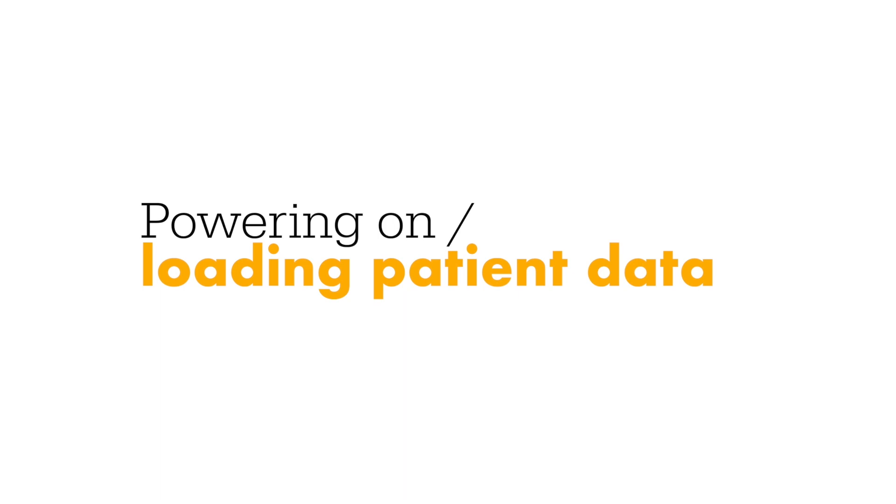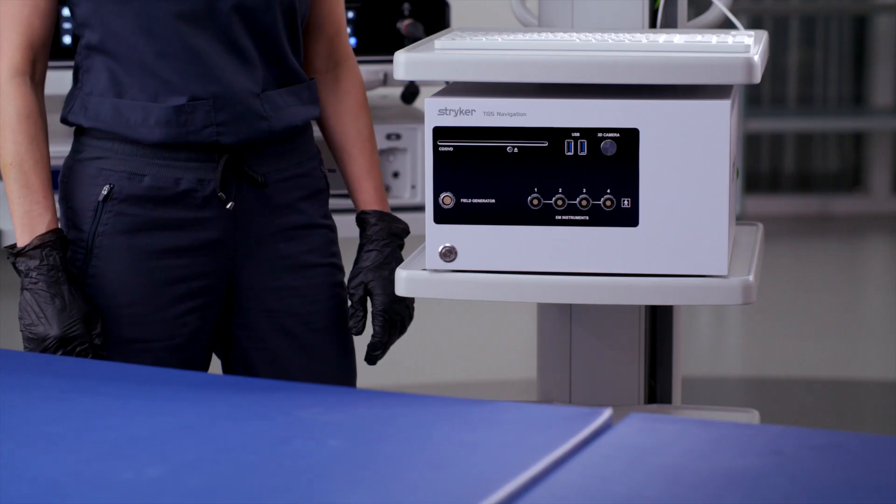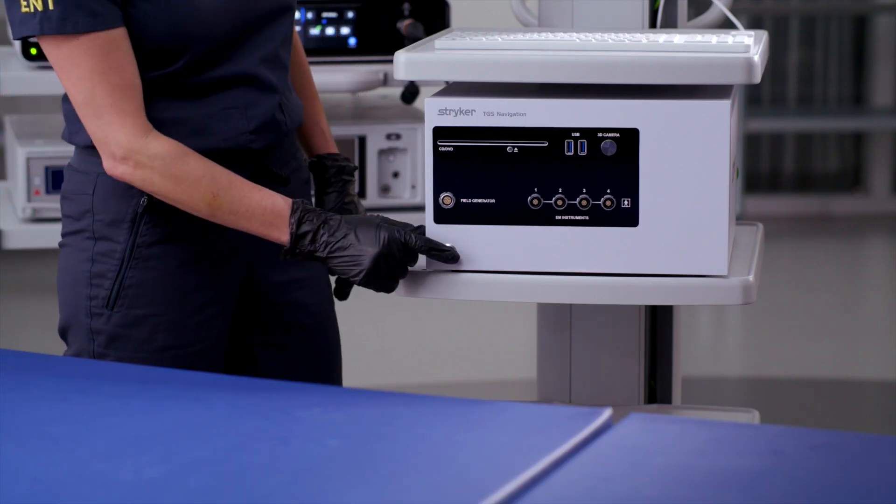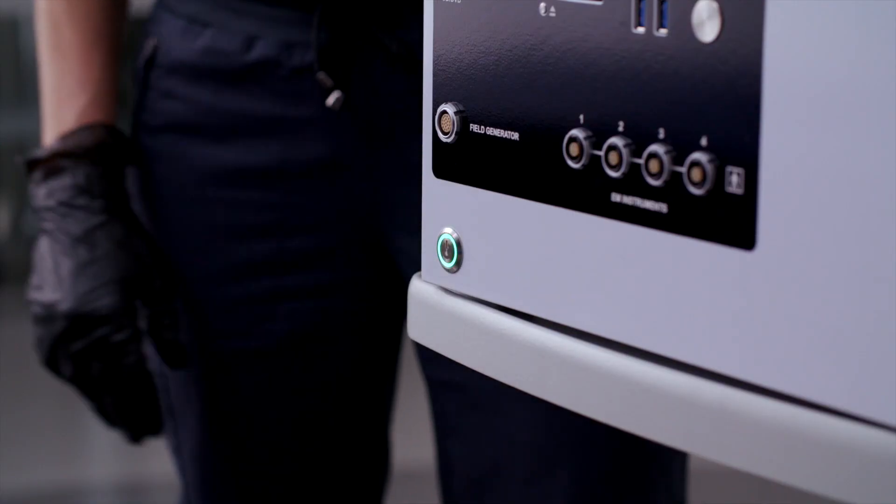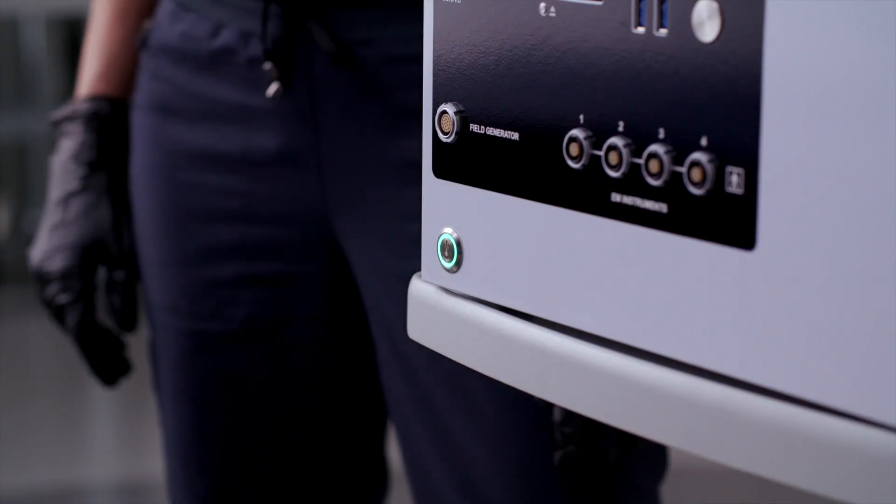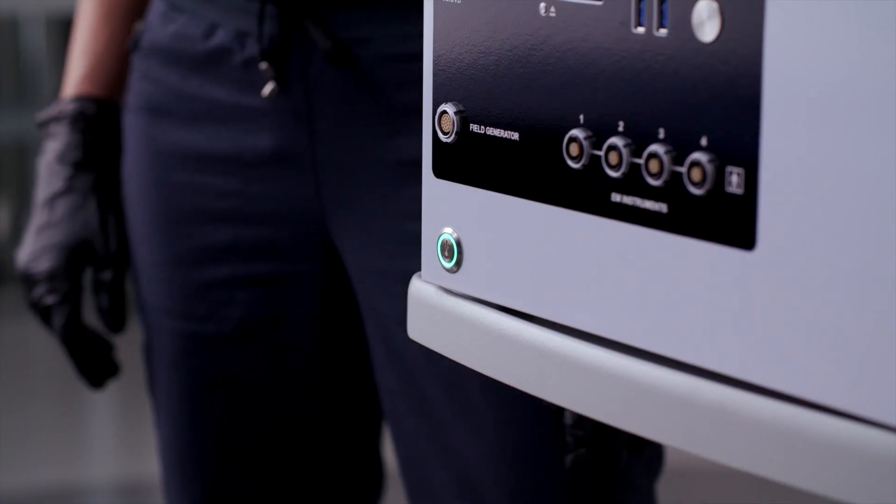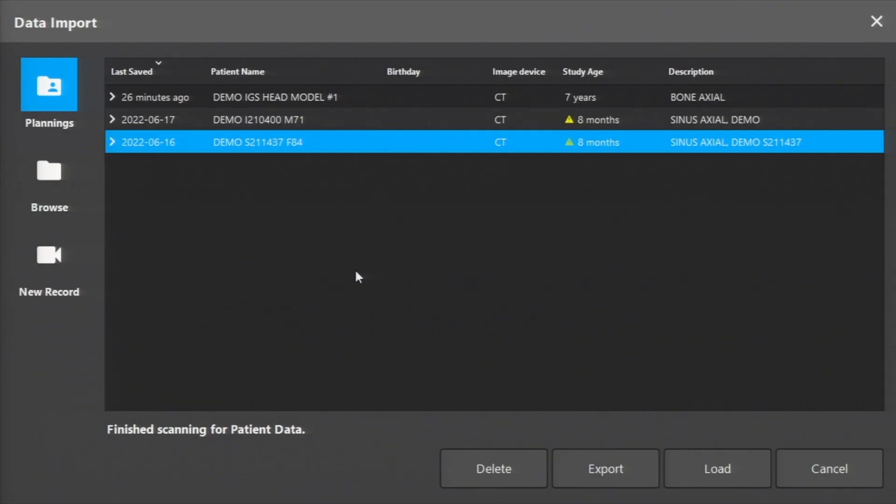To power on the ENT navigation system, press the Power button in the bottom left-hand corner of the console and ensure that the green light becomes illuminated. Once the unit has powered on, double-click the Scopus software icon on the desktop. The patient loading screen will appear, and you can now upload a scan onto the system.